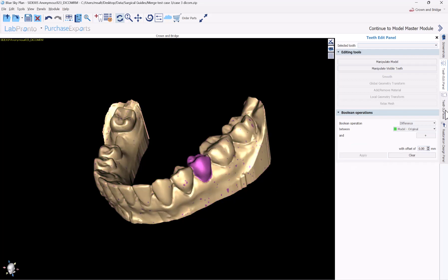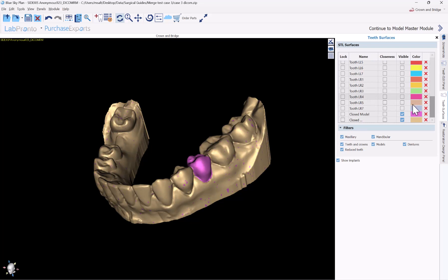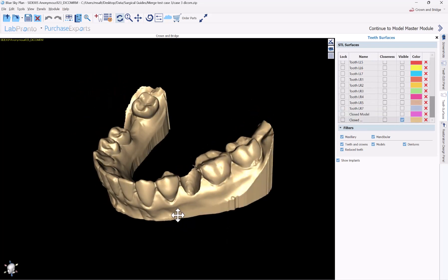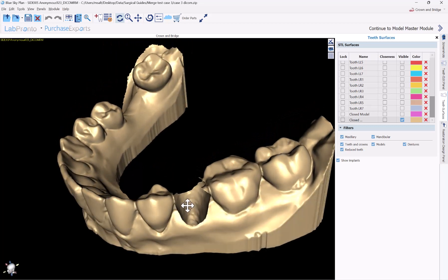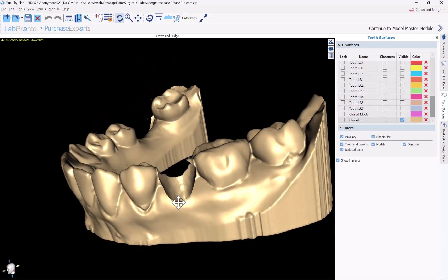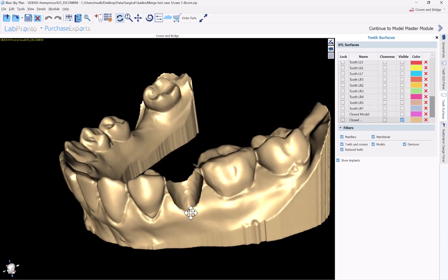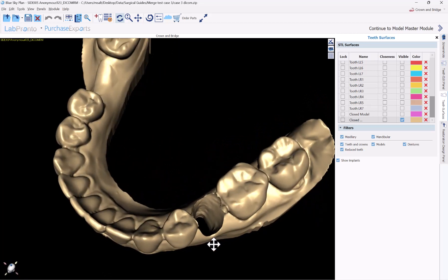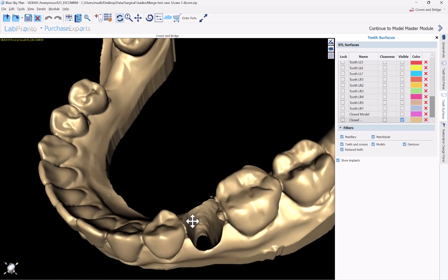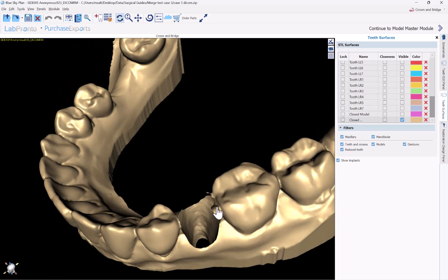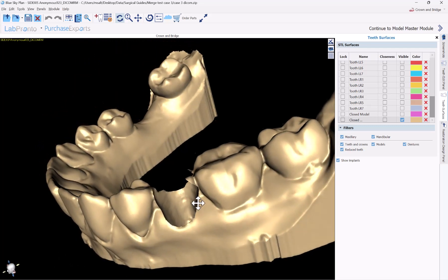Now we have a new surface. If we switch over to the teeth surfaces and scroll down, we can see our new surface. If I hadn't used the offset, that would have been fine, but we may have been left with a few floating pieces of the model if there wasn't 100% alignment between the extracted CT scan tooth and the model itself. This is actually quite a clean extraction, though we do have some extra pieces.